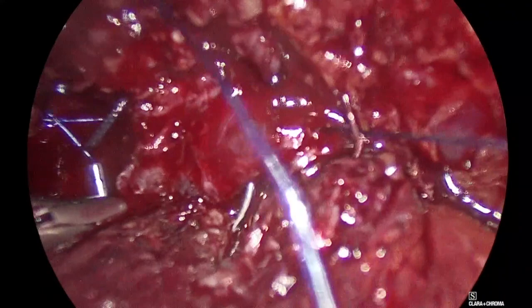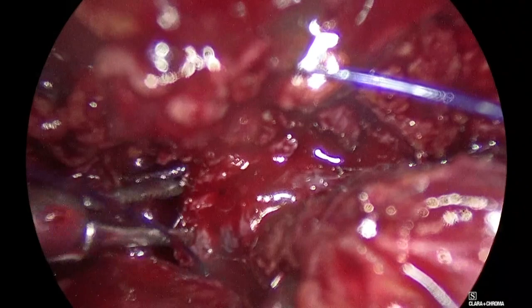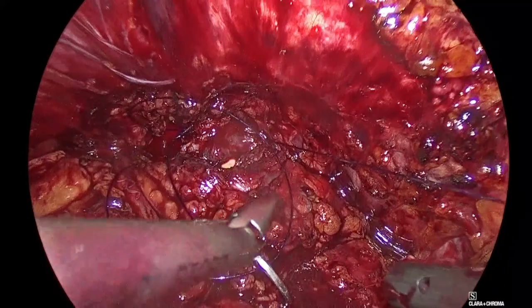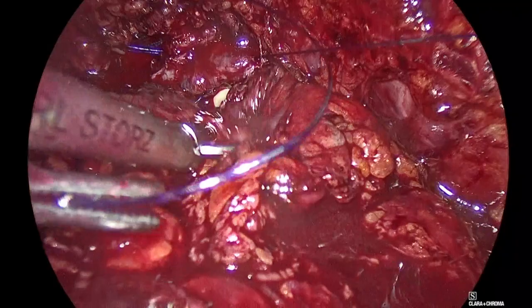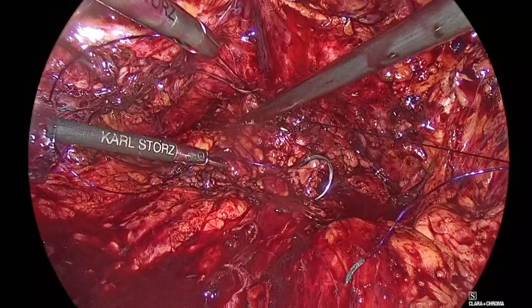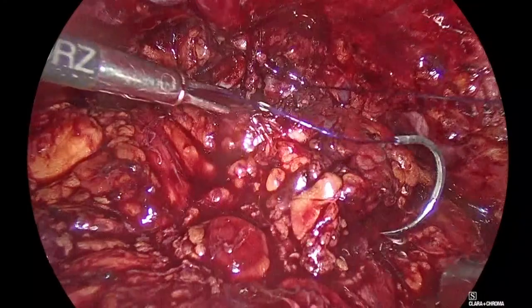Backhand stitches are very much easier when you do them in one step, as you see here. Both bladder and urethra in one step. Otherwise, they can be quite difficult. Okay, this goes down. Wait, not yet. Evangelos, I have a question for you. In the era of robotic surgery, do you think the laparoscopic approach for the prostate has a place, or only in limited situations? I'm a big fan of laparoscopy. I also do robotics. This is a huge discussion.